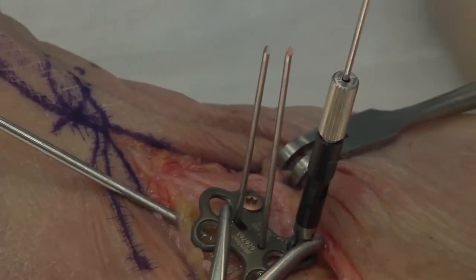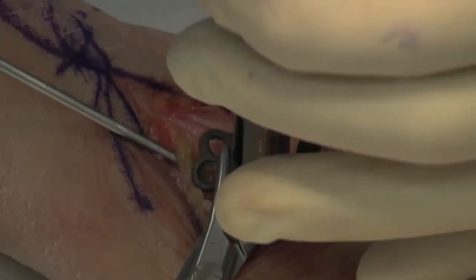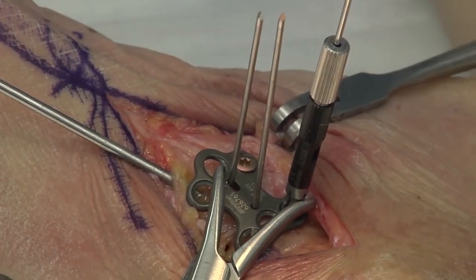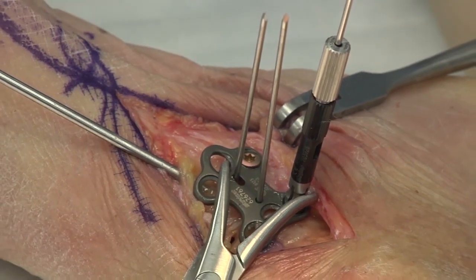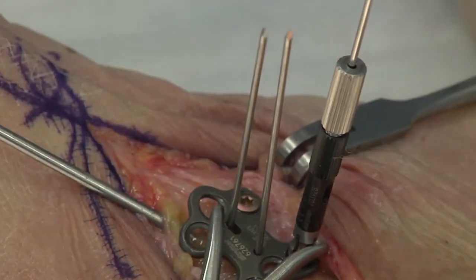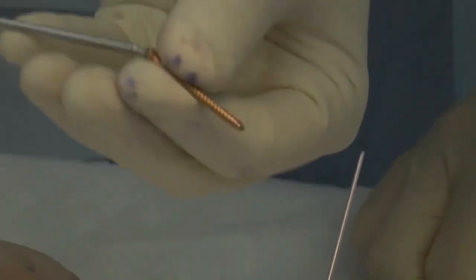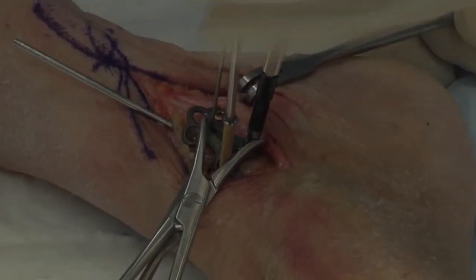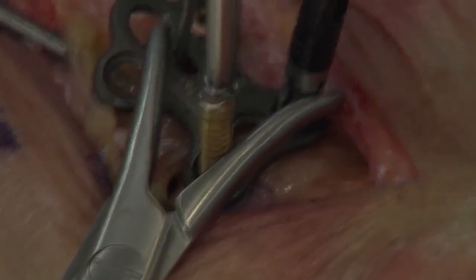Go ahead and exit through that lateral cortex — this we will measure. You should be able to appreciate that lateral cortex with a depth gauge; as I mentioned, it's usually going to be in the 36-millimeter range, give or take. We'll go ahead and put a locking screw in here just to demonstrate. These screwdrivers are star-shaped, they're locking, and they hold your screws very well. These can be driven on power, by hand, or by ratchet.